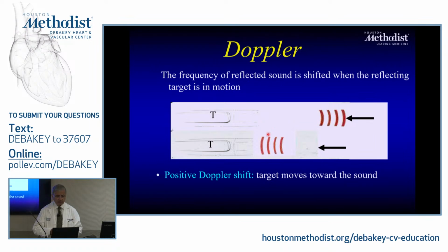Okay? So a great example of this is in real life. You just walk outside on the streets and you'll be able to do that. There are a lot of examples. We'll talk about them. But basically, if an object is coming towards you, these waves are compressed. So the frequency increases, and the delta frequency is in kilohertz. And if this object is going away from you, then it decompresses, and therefore the wavelength is longer, the frequency is lower by that magnitude.